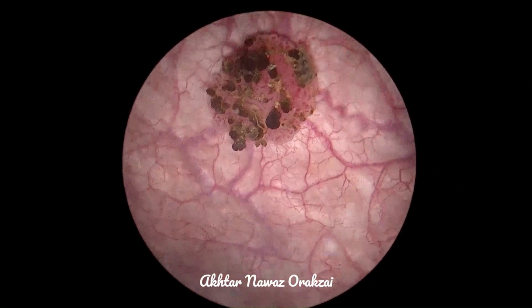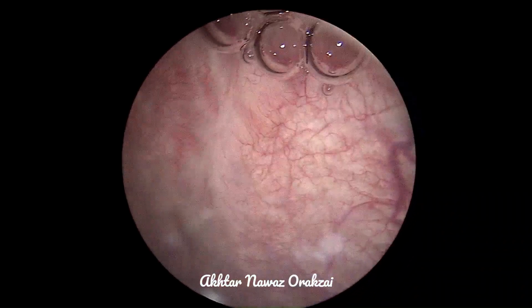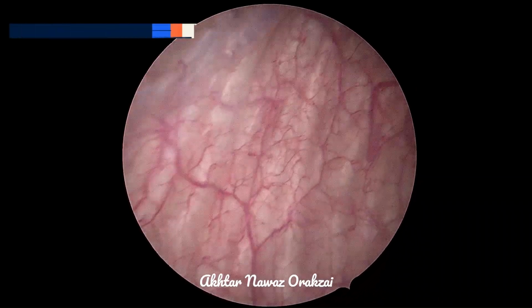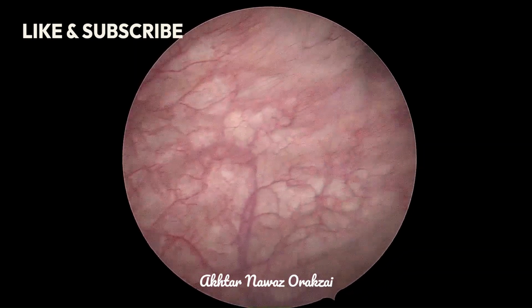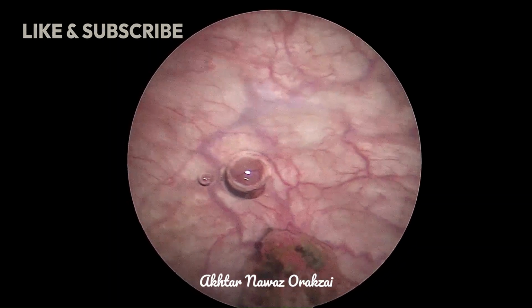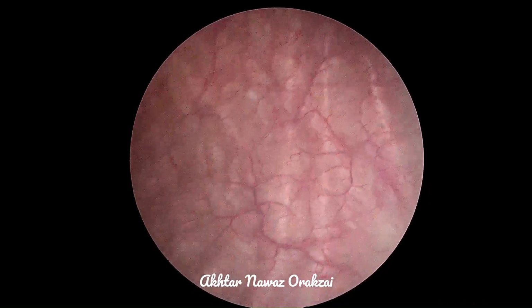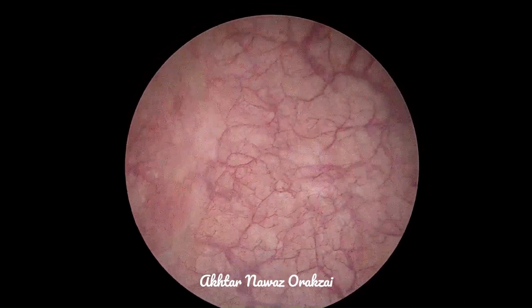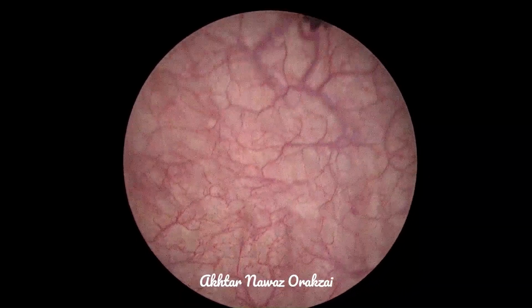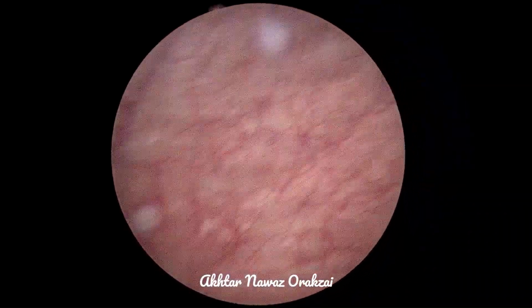However, following that vessel has led to diagnosis of this small papillary growth. This again is the resected area. So this shows that there were multiple small lesions on the anterior wall, the posterior wall, the right lateral wall, the posterior lateral wall, the left lateral wall, on the dome as well. However, those areas are still clean and clear, and there are no growths or no recurrence.